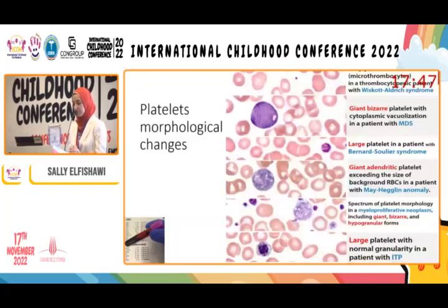As for the morphological changes, platelet morphological changes are a bit scarce, but you can find tiny platelets, giant bizarre platelets, large platelets, dendritic platelets, hypogranular platelets.